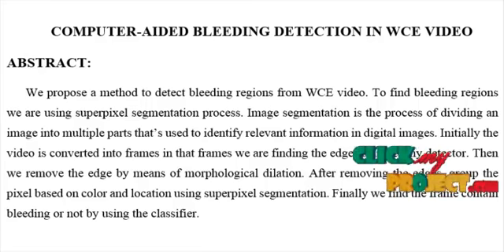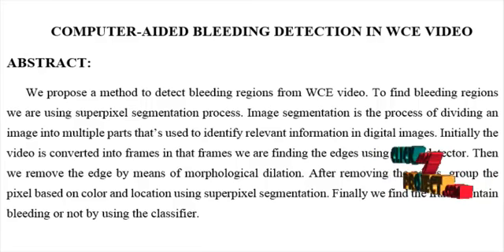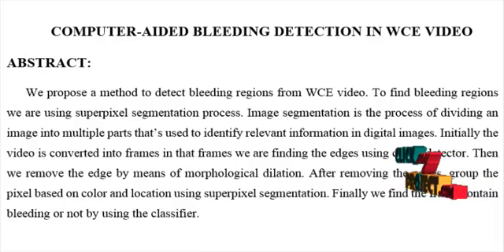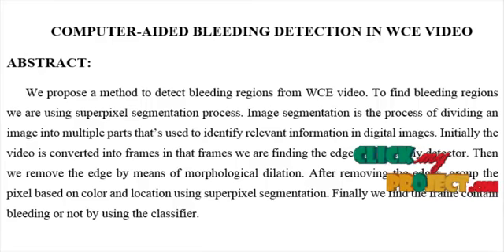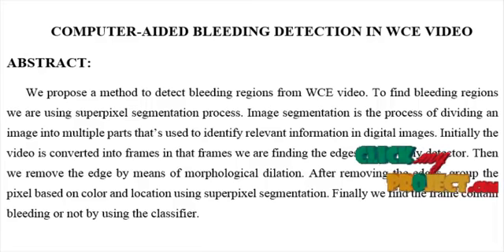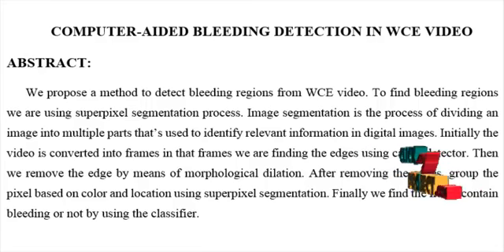The dilation of the images produces a binary image in which all the locations of the structuring element were combined, and if it hits the particular zero positions, then it replaces all the pixel coordinates. Dilation has the opposite effect of erosion. It adds a layer of pixels to both the inner and outer boundaries of the regions.